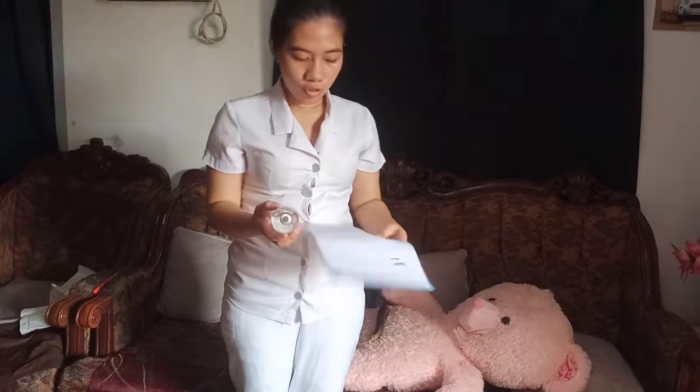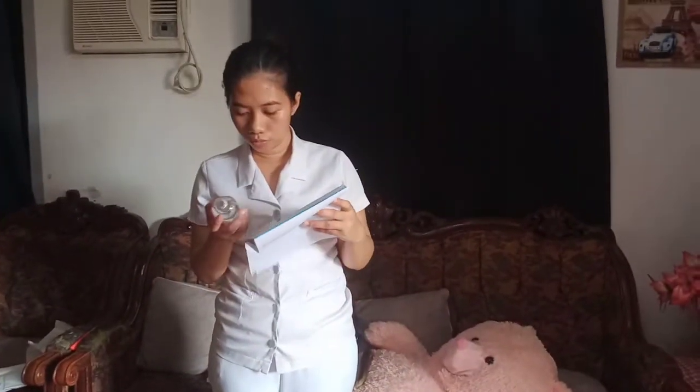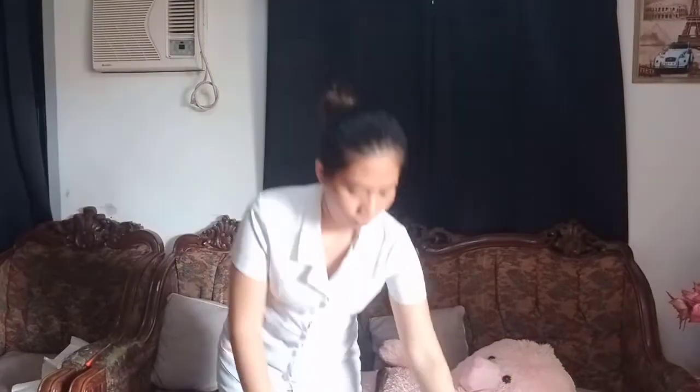Insulin. Okay. Then check the label on the medication carefully against the AMR to make sure that the correct medication is being prepared. Then follow the three checks for administration of the medication. Read the label of the medication when it's taken from the storage, before withdrawing the medication, and after withdrawing the medication. Now we're going to organize the equipment to save time and effort.